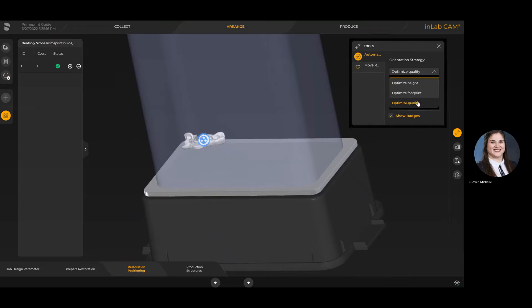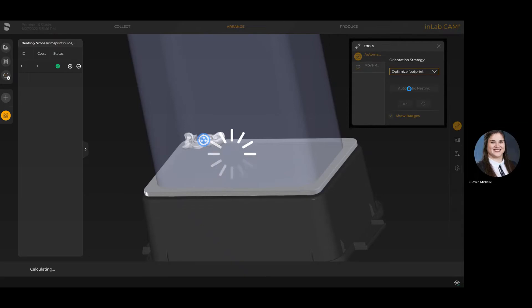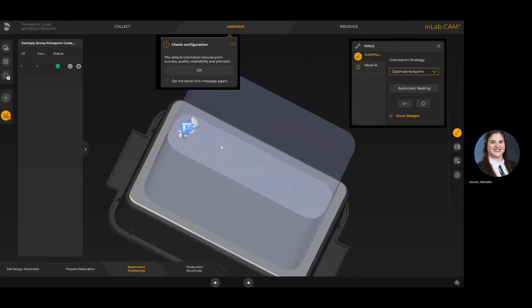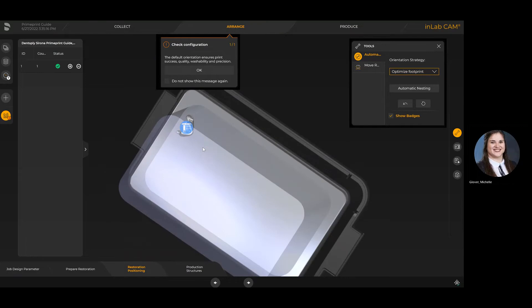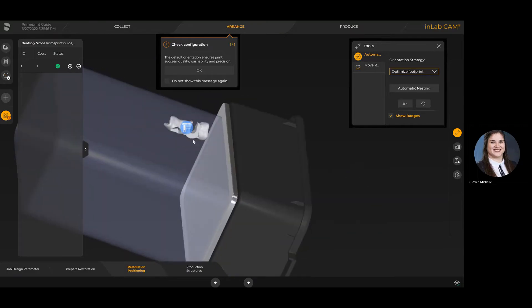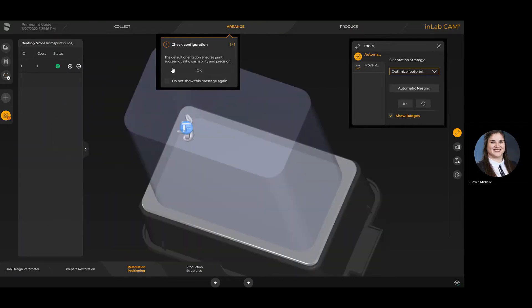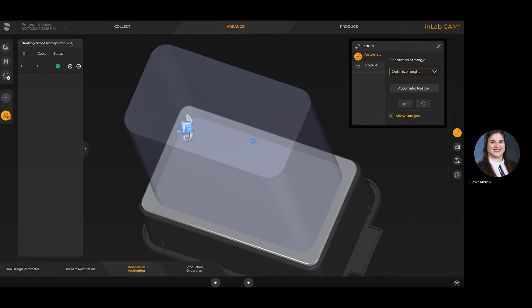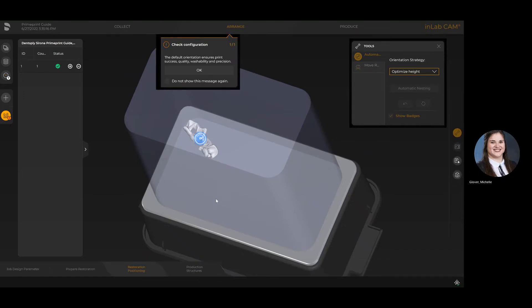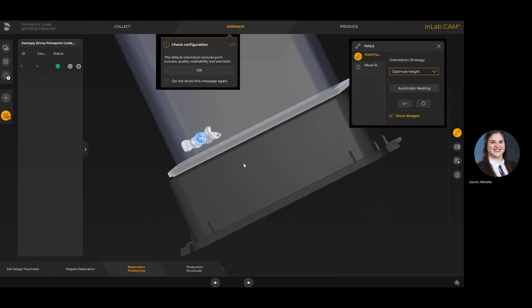Optimizing the quality assures that you're going to get a much better print overall, the best possible fit and everything like that. Now I've changed it to optimize footprint. Optimize footprint is going to take a little bit longer in terms of printing because you're seeing more layers here. However, it will allow me to print more on the actual build tray.